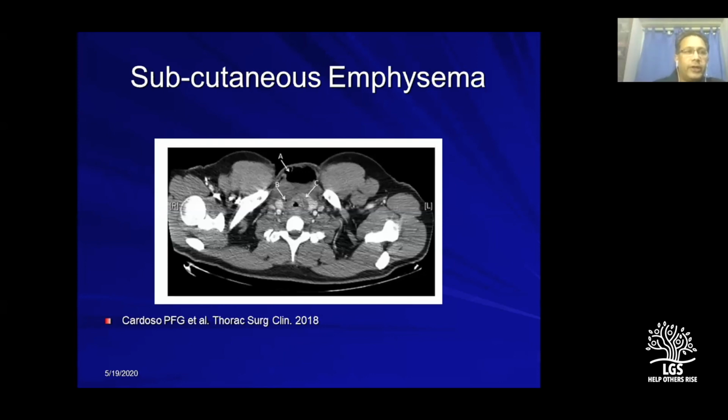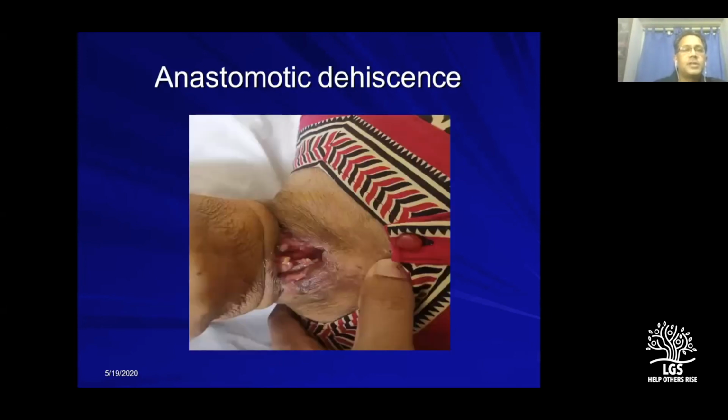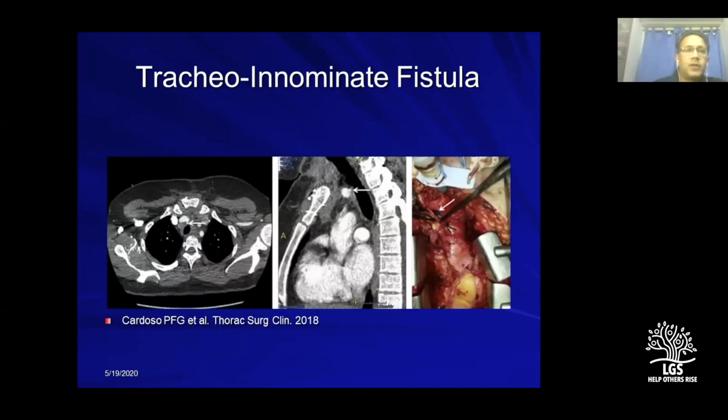Go intubate the patient very carefully with a fiber optic endotracheal intubation or a rigid scope, whichever is your technique, and then subsequently go about the surgery. This was one of our patients who had such a problem, an anastomotic dehiscence, and subsequently it is shrinking down. So we did a tracheostomy through the same incision, and she is due for closure. So in some odd cases you do get some emphysema, and we have to be very careful, especially if they are associated with respiratory distress.